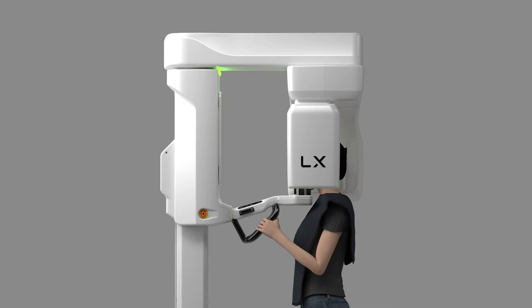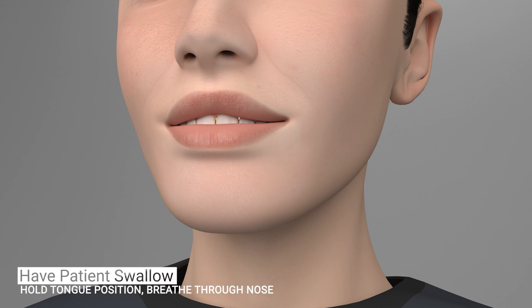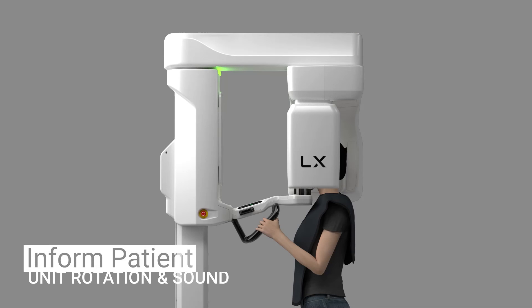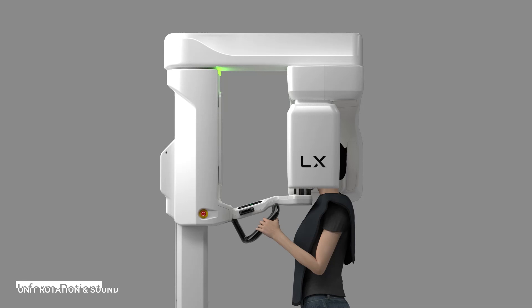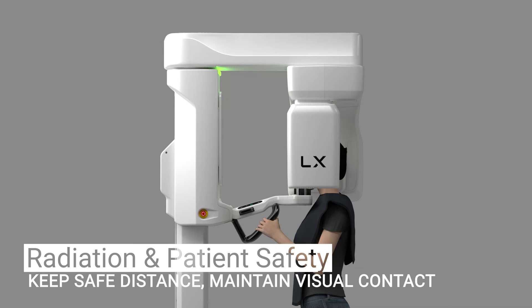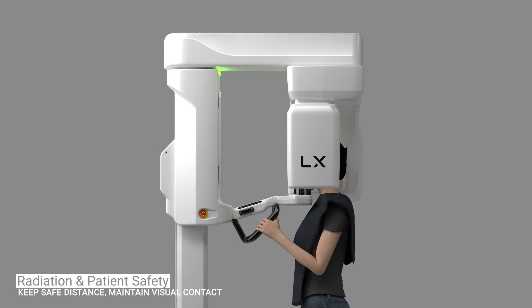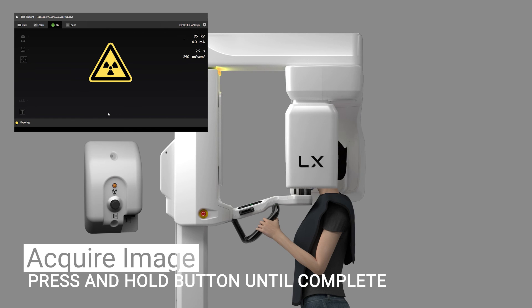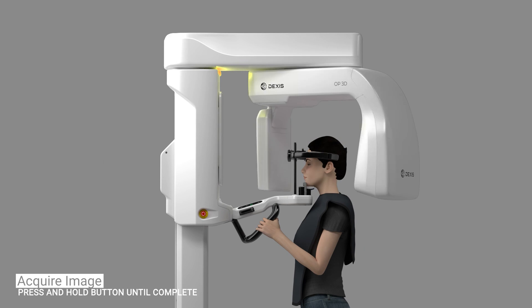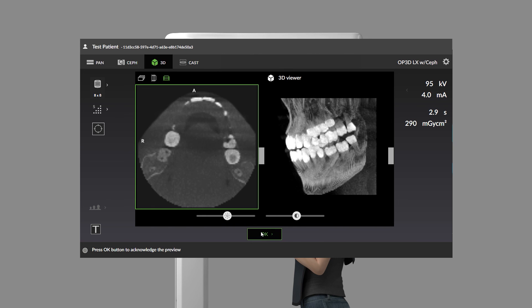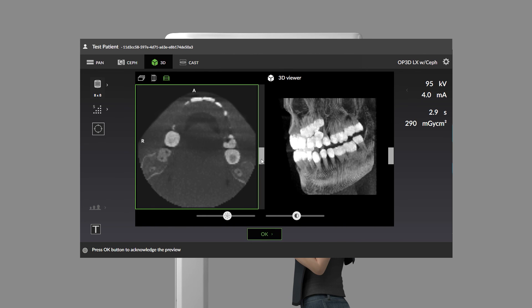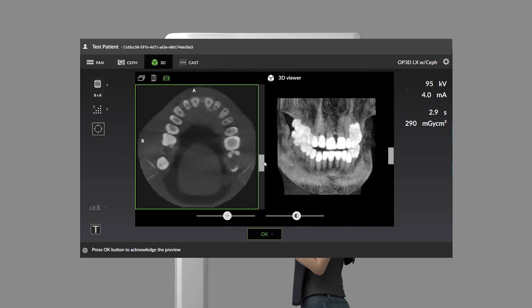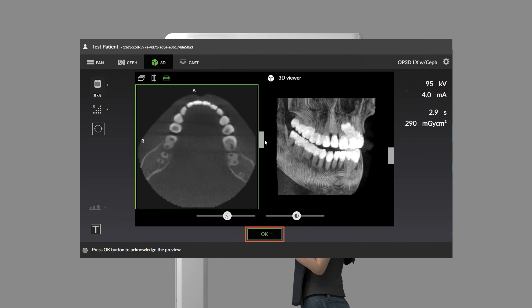Ask the patient to swallow, hold their tongue position, breathe through their nose, and remain still for the duration of the exposure. Inform the patient the unit will rotate around their head and an audible sound will occur. Protect yourself from radiation in accordance with local safety guidelines and regulations while maintaining visual contact with the patient during exposure. Press and hold down the exposure button until the process completes. A preview image appears on the GUI for review. Use the sliders to preview the 3D slices, change the projection views, and adjust the brightness and contrast. Select the OK button to complete the image acquisition.